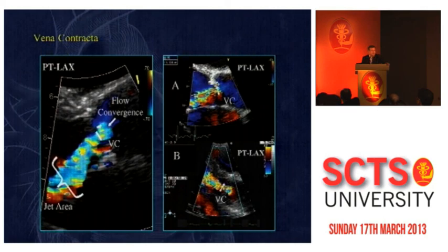So this is my last slide. As I said initially, when you make this assessment, given the emerging body of evidence, you need to have several different methods that have been used with echo or other types of imaging methods that will lead to the conclusion that you are dealing with severe aortic regurgitation.